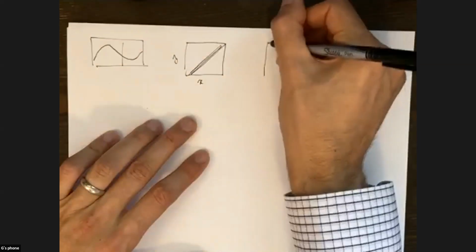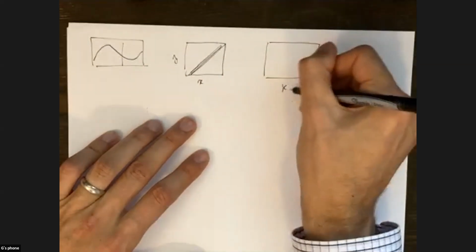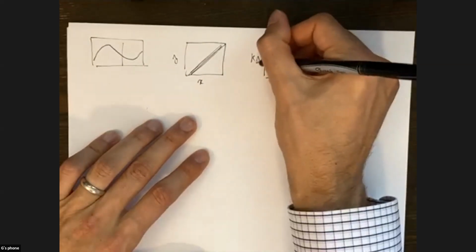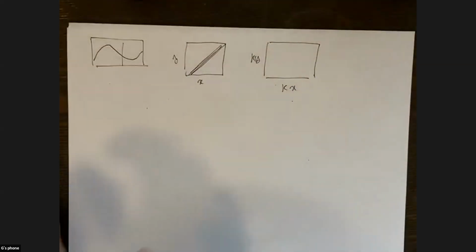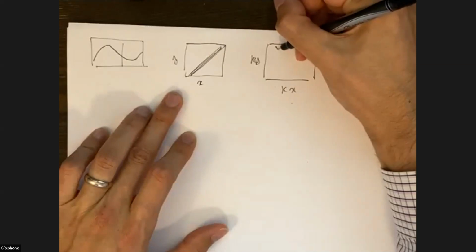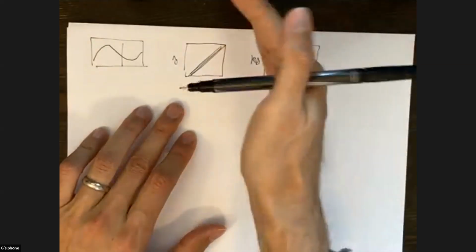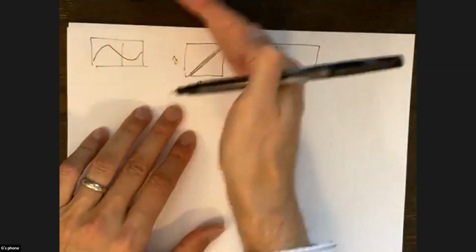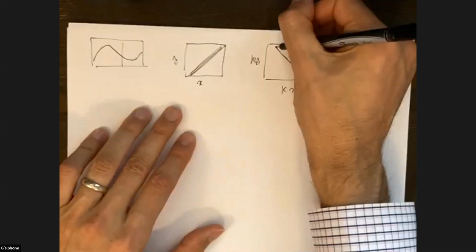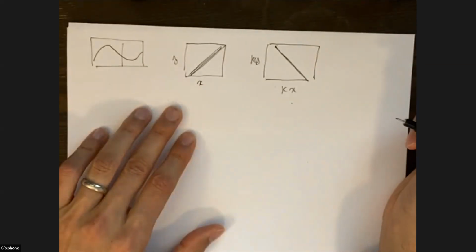In the frequency domain, when we do simple back projection, this is what happens. So now this is kx, ky. By back projecting, we are filling in the spectrum. For this first one, by back projecting, we're basically filling in this part of the spectrum. It's perpendicular to the direction, because the projection is taken along this axis. That means we're collecting information in the perpendicular direction here. So that would be the first.